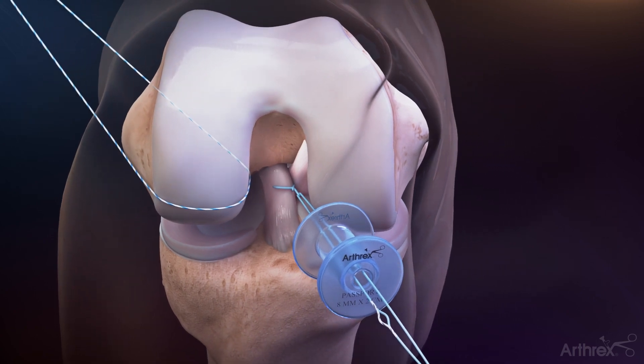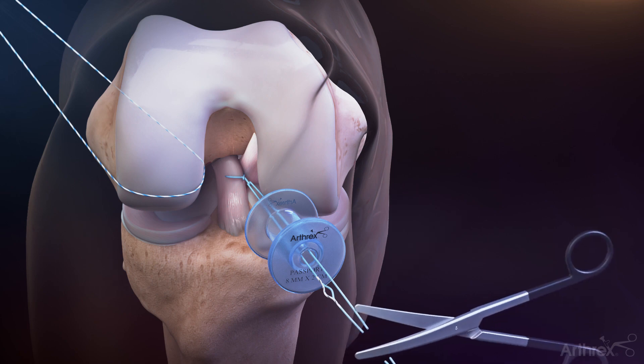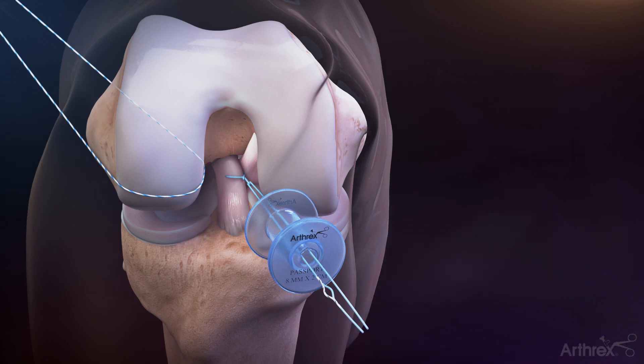Multiple fiber ring sutures can be added as needed. Use a fiber wire scissor to cut the fiber ring shuttle loop just below the splice, leaving two tails.